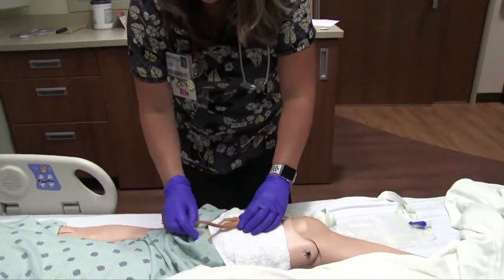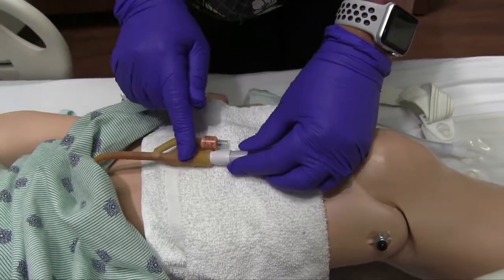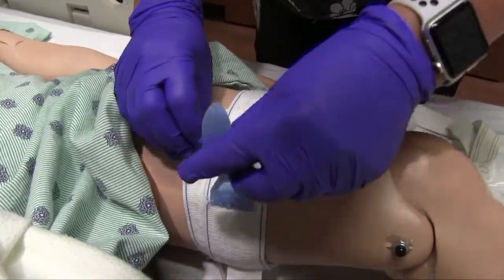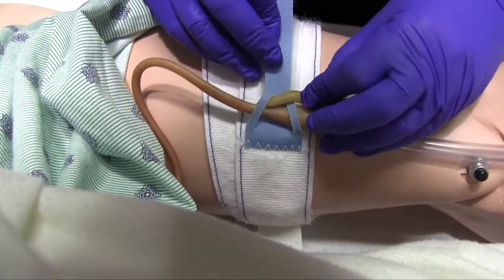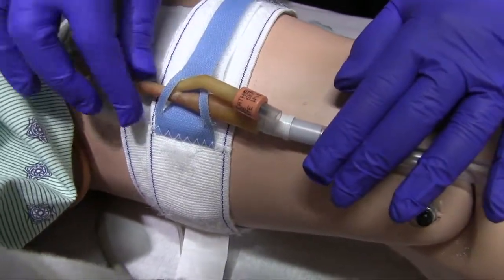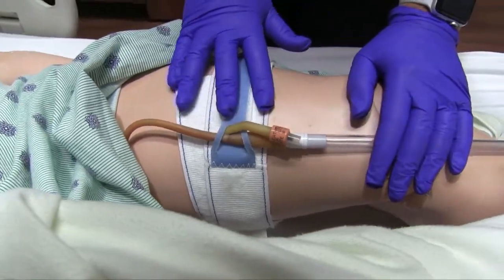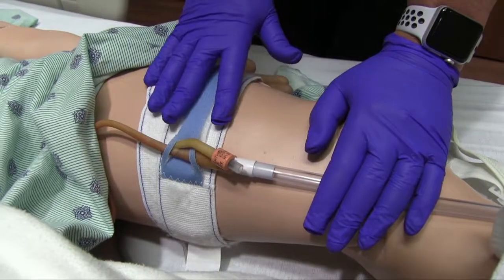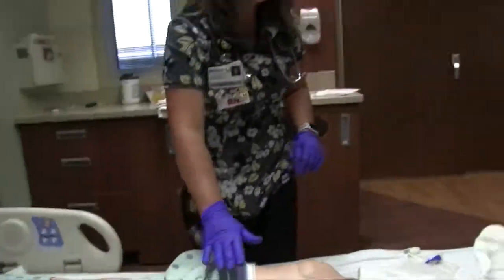Okay. So, as you see, with the other system we had a blue port, and with our leg bag we do not have that blue port on this system. So securing it's going to be just a little different. You're going to lift this strap up. You're going to place your catheter in it, and then secure it just like such. Now, this is not as secure as the other bag. There is no specific port, so it can move a little bit. So be precautious. Don't wear tight pants. Wear some loose-fitting clothing when you do this, okay? If you notice any tugging, you do need to just investigate really quick and make sure that your strap has not moved down or up your leg, okay? Questions over that part? Okay, perfect.